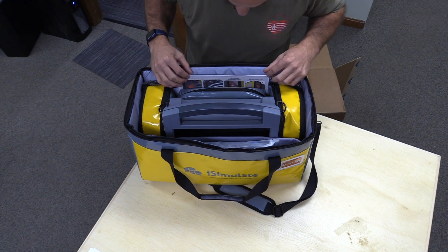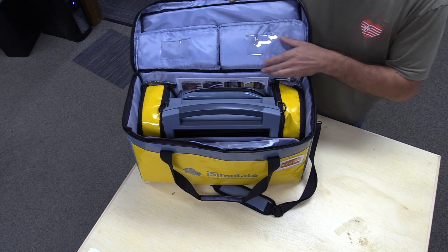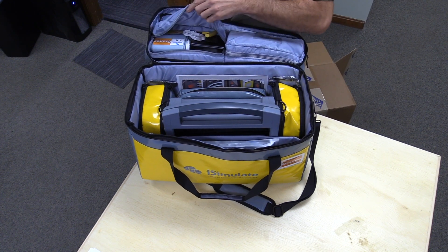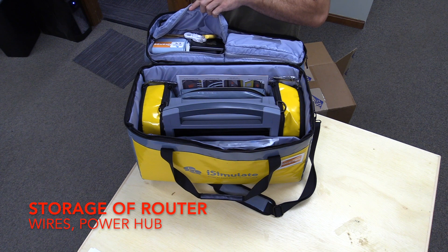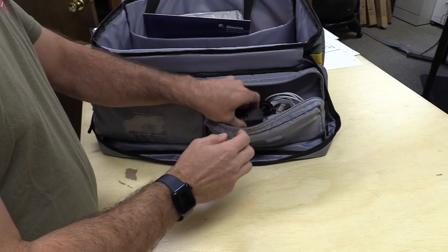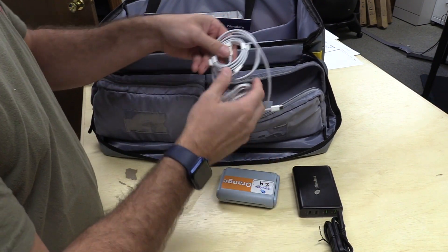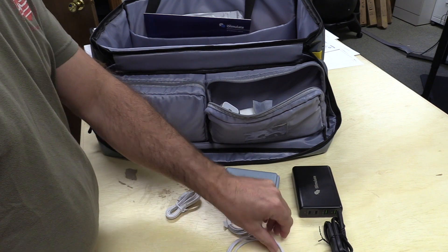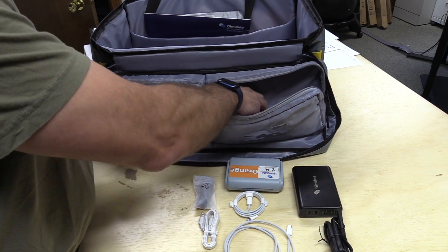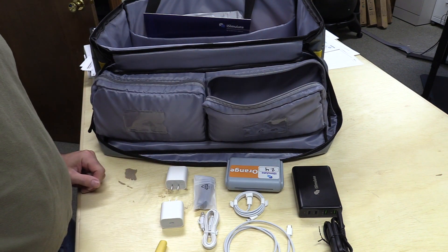Once you open the kit, you'll notice there are a whole bunch of different pieces and parts inside. On the top flap of the carry case, there are a couple of storage pockets which include a lot of the equipment you're going to need for setup, including your router, wires, and power hub. Let's go ahead and take out the USB hub, the router, the power wires for the router, power adapters, and such. Set them to the side and we'll get back to those in just a minute.